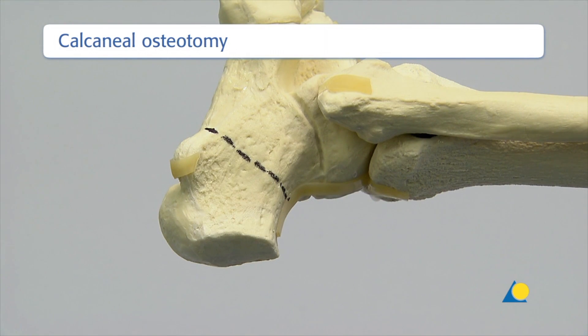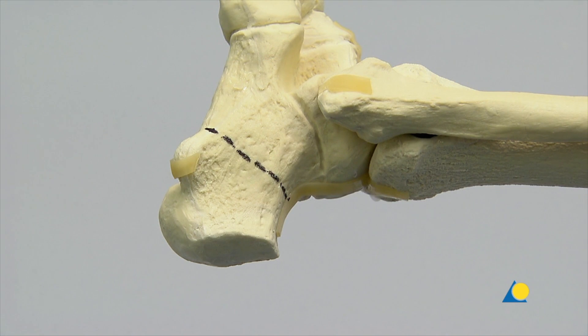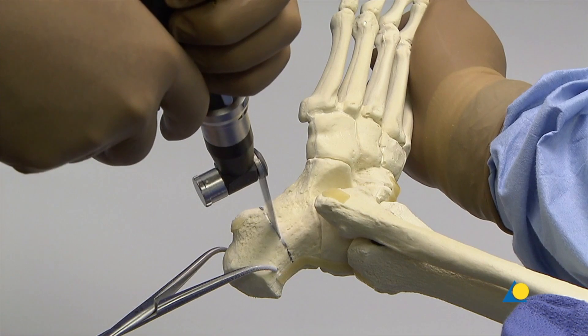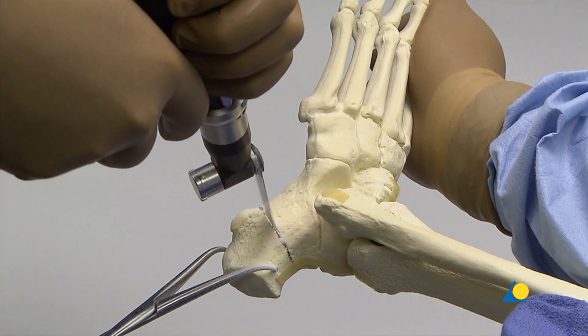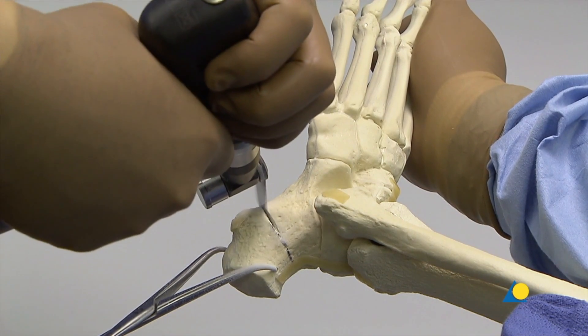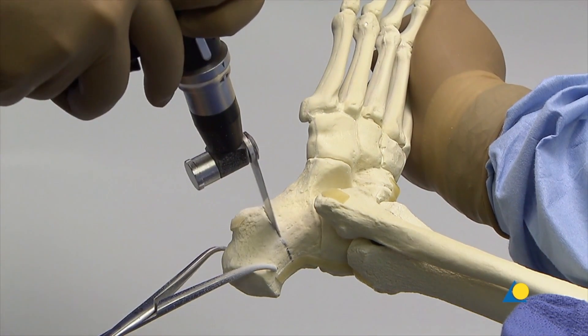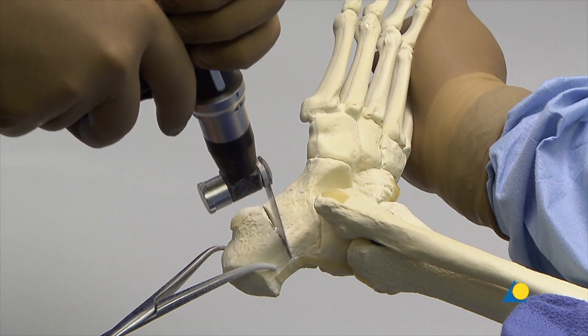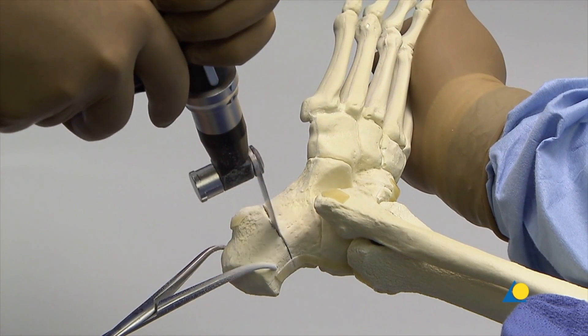The planned position of the osteotomy to correct a varus deformity is marked. The osteotomy should be made through the mid-portion of the tuberosity, almost perpendicular to its long axis. The osteotomy is made using the oscillating saw. Care must be taken that the osteotomy is perpendicular to the sagittal axis of the calcaneus, otherwise it may be difficult to maintain the desired correction during the fixation.